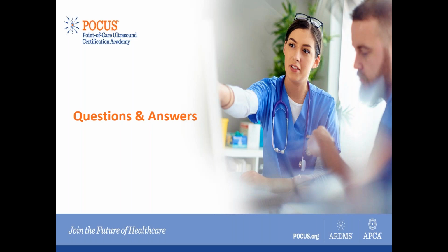Thank you. The next question that has come in is, what about any medical legal issues that may arise? That's the question that comes all the way. I'm not a medical legal expert, and I'm not a lawyer, but keep in mind that when you do a study and you make judgment or you try to treat a patient based upon your observation, then you will be medical legally liable.